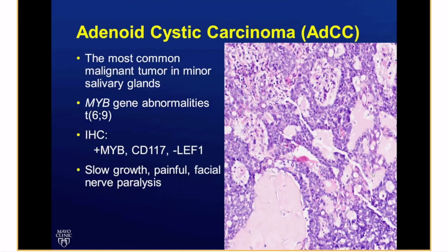So this was adenoid cystic carcinoma, and this is the corresponding resection. You see here the hyperchromatic cells surrounding this matrix, and this matrix forms globules of varying sizes with a little bit of molding and very hyperchromatic looking cells.